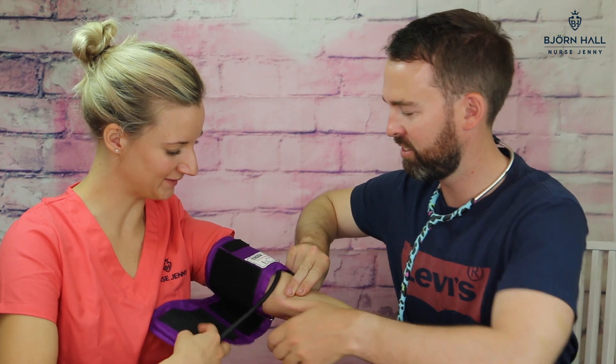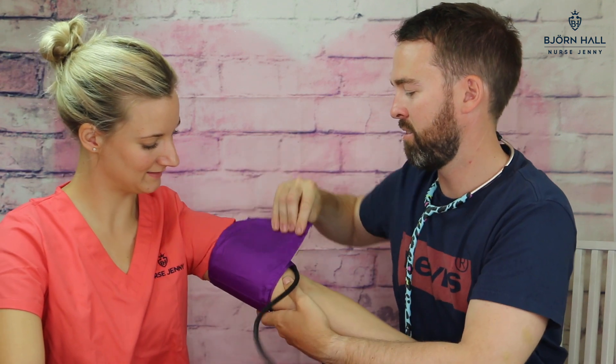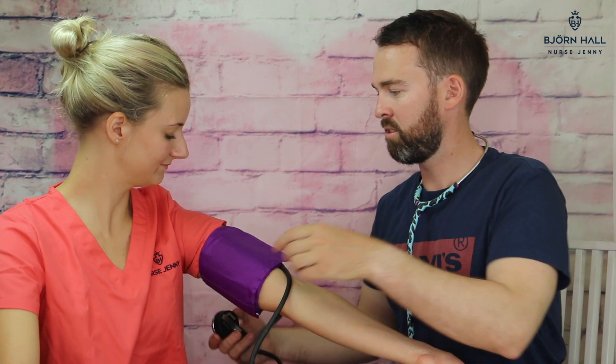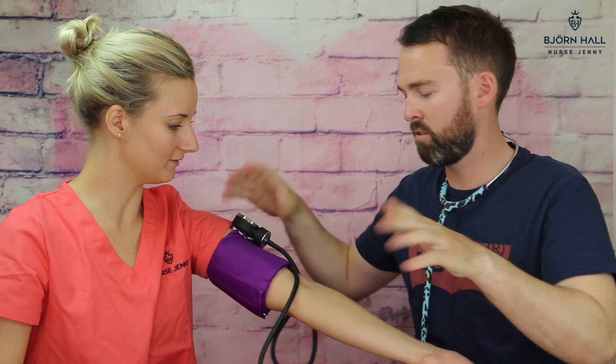Okay, I've got it. So I've lined that one up. And then I'll put this one up here.